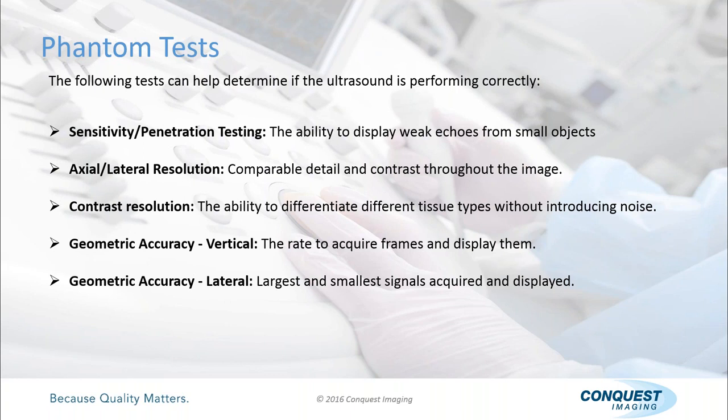But I find in my experience that most hospitals have at least one department, normally women's imaging or breast center, that is almost always ACR, American College of Radiology, accredited. And when you are accredited, they have some very specific tests they like you to run. And some of them, or most of them, require a phantom.